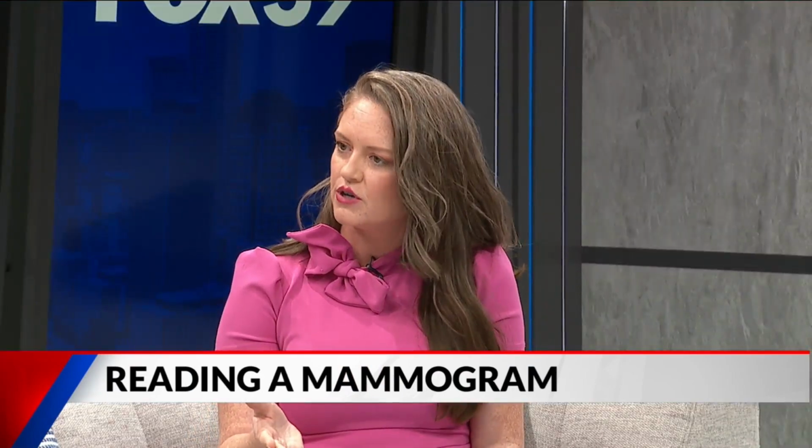It's interesting to hear what you do. So as a radiologist, you're reading these mammograms. What are you looking for? Because to the rest of us, they just look foreign. So when we interpret a mammogram, we're looking at multiple things. First of all, we're evaluating the density of your breasts. There are 4 different categories for density. There's fatty breasts, there's scattered breasts, there's heterogeneously dense breasts, and extremely dense breasts.